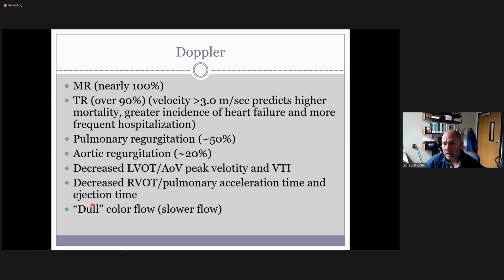I think from a student perspective, it's better to train on the fly and do your measurements on the fly and start to form that data in your head so that you know what's going on, so it doesn't make it more complicated when you miss something. Because early on, you're going to miss a lot of stuff, unfortunately, especially as a student. But even as a new tech, you're going to miss things, and you want to be on top of that.